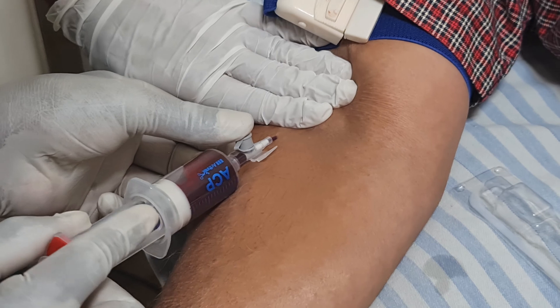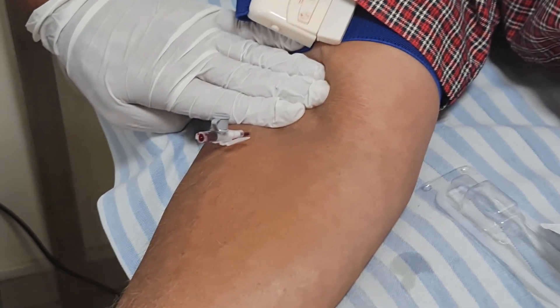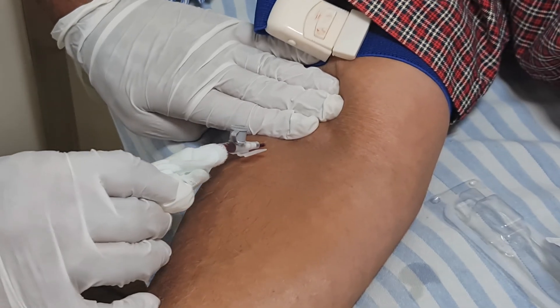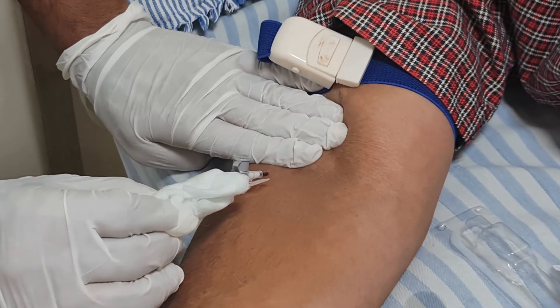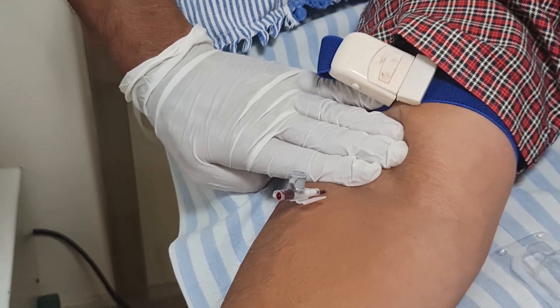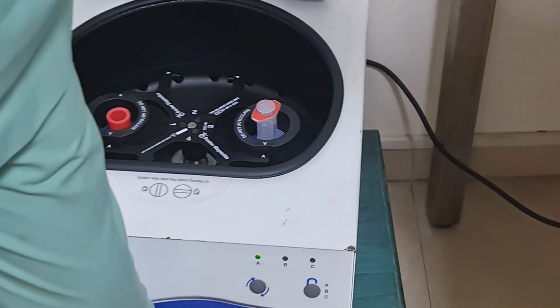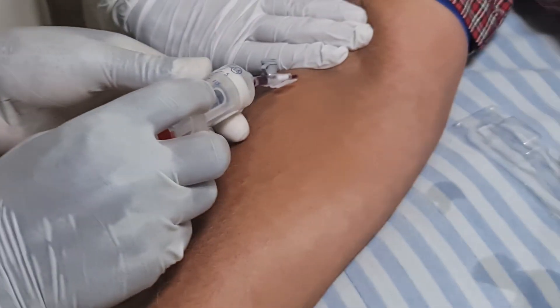Now he is going to withdraw blood into the second syringe. Because we are injecting 2 knees, we will be withdrawing 30 ml of blood. We have already taken 15 ml and now we are going to take another 15 ml. He just placed that syringe in the machine and we have got one more slot for the next unit of blood.